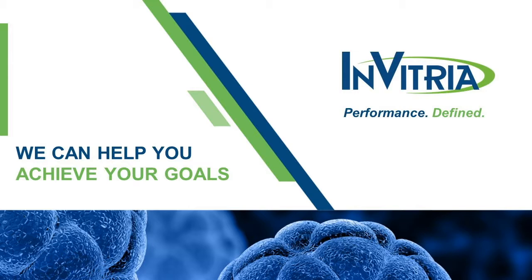We know that T lymphocytes are a bit of a transferrin hog, and honestly, our experience has been that you want to bring that transferrin up to between 30 and 50 mg per liter. At a 1X concentration of ITSE, it's only 5.5 mg per liter, and you're absolutely going to see the difference in expansion capabilities, especially in more confluent cultures.